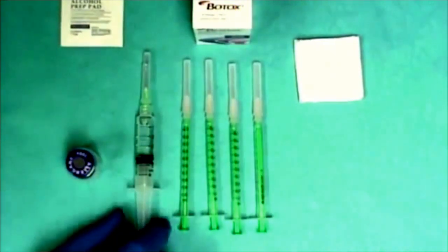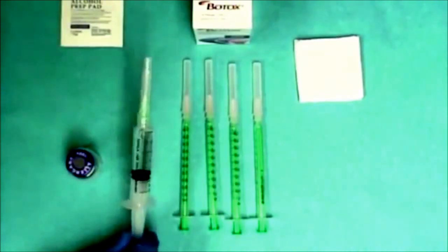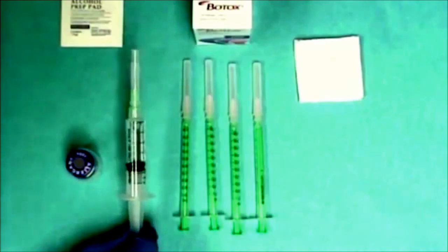I'm using today my favorite sizes for needles and syringes, which are the 3cc syringe, 22 gauge, one and a half inch long needle.